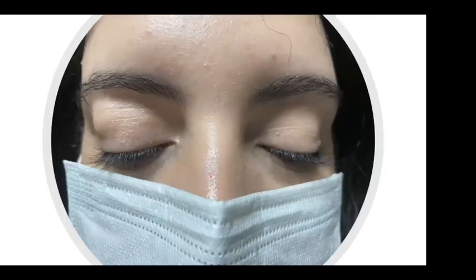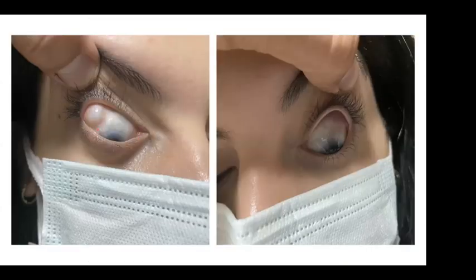Look at this girl, she received a bilateral implant, so you can see the right eye. The implant is very prominent. The left eye, there is nothing, but she received an implant for this. She's an only eye patient. This eye is an absolute eye with the implant very anterior, you see. And this one, there is an implant which is very posterior.